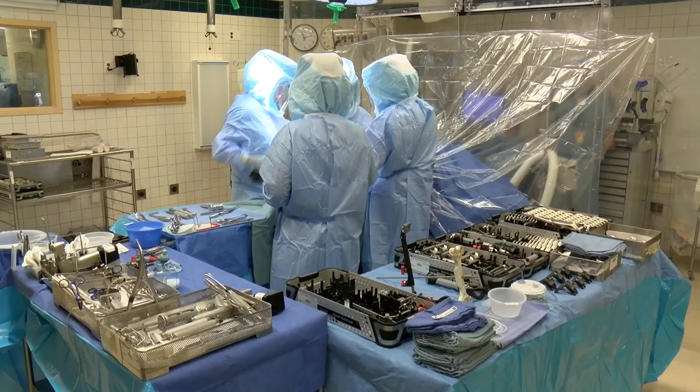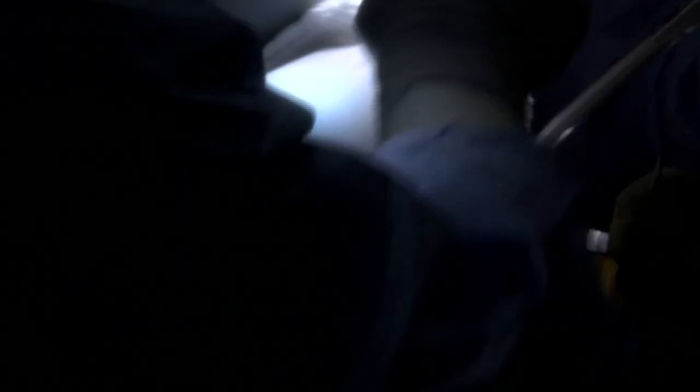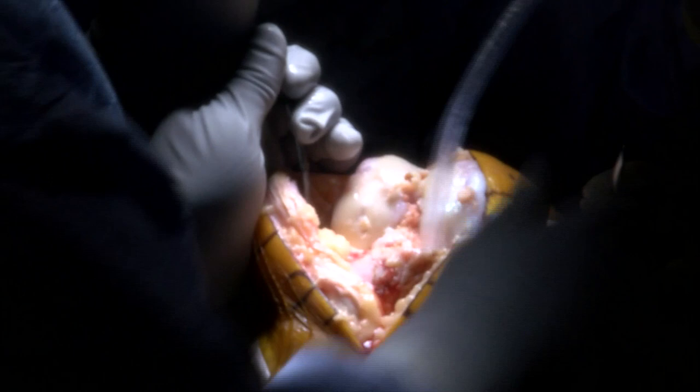Nearly 600,000 knee replacements each year in the U.S., so this is a very common procedure. Dr. Fitzgerald, I know this is something you're quite adept at. Yeah, I do both hip and knee replacement — between hips and knees, I do close to 500 a year.